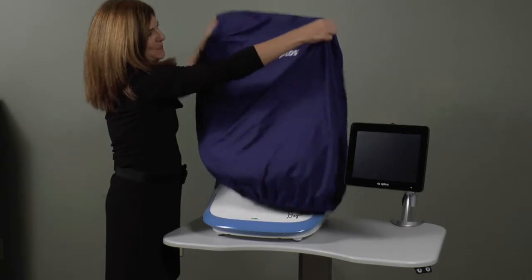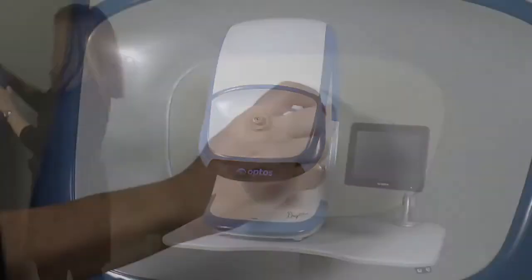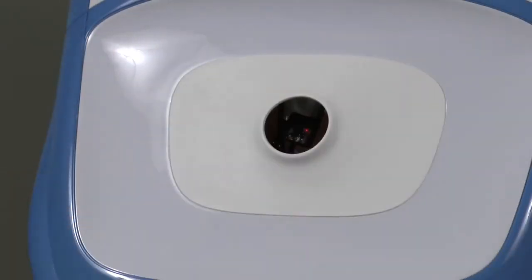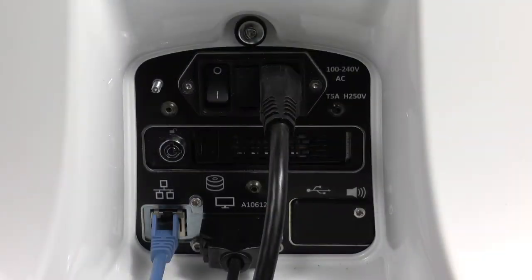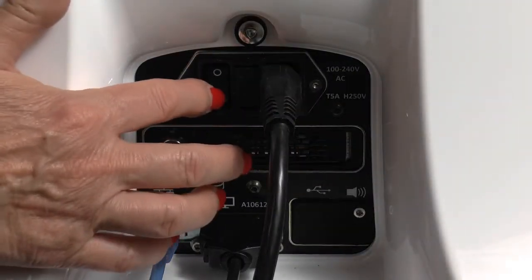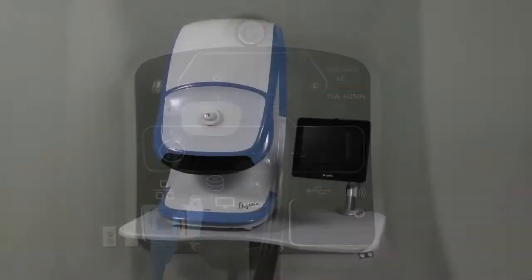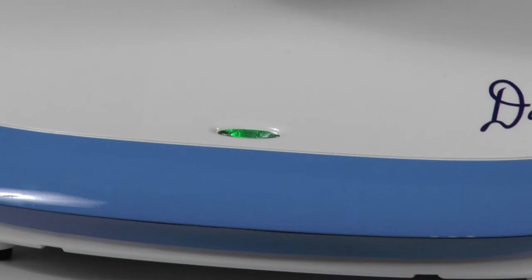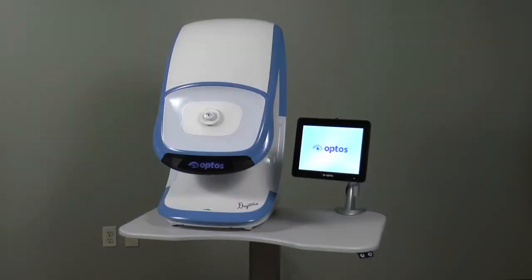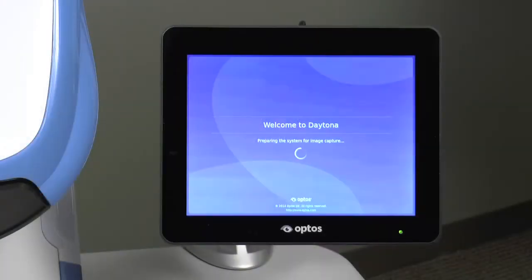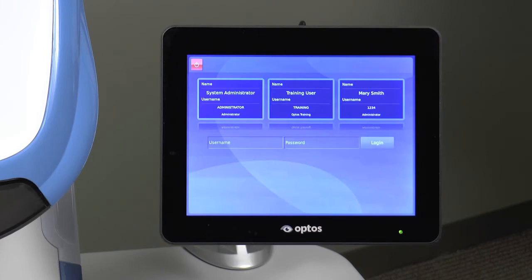At the beginning of each day, remove the dust cover and dust cap, then locate the on-off rocker switch on the back of the Daytona and switch to the on position. The indicator at the bottom of the device starts off green, then turns white while it is going through the pre-checks, which take approximately 3 minutes. While the device is warming up, the tablet will cycle through a number of screens, and then when ready, the login screen will appear and the indicator light will turn green.